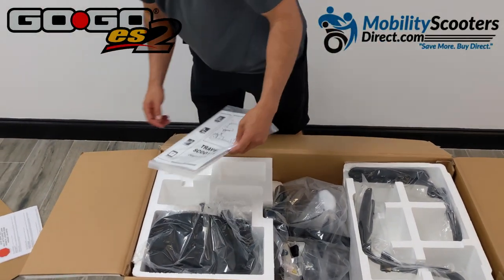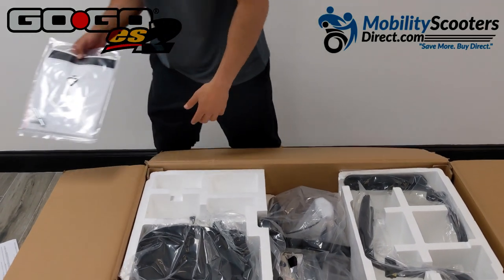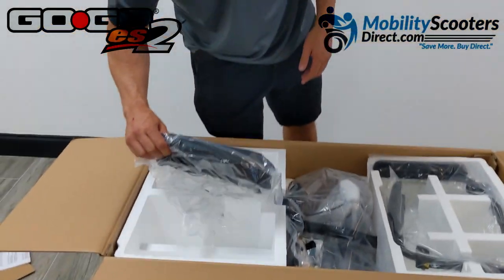We do highly recommend reading all of the material in this packet. It comes with the user manual and a couple of adjustment pins, which we'll show you how to use in just a moment.